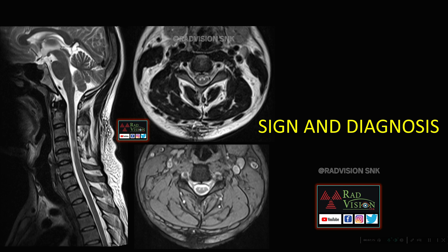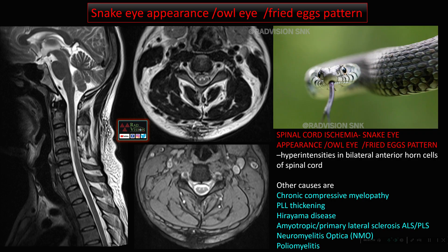Next case — guess the sign and diagnosis. This is a sagittal T2 weighted image of the cervical spine showing hyperintense signal in the center of the cord. On axial T2 weighted and GRE images, two hyperintense areas are clearly seen predominantly in the anterior columns of the spinal cord. This mimics the appearance of a snake eye — classically called the snake eye appearance, or owl eye appearance, or fried egg pattern.